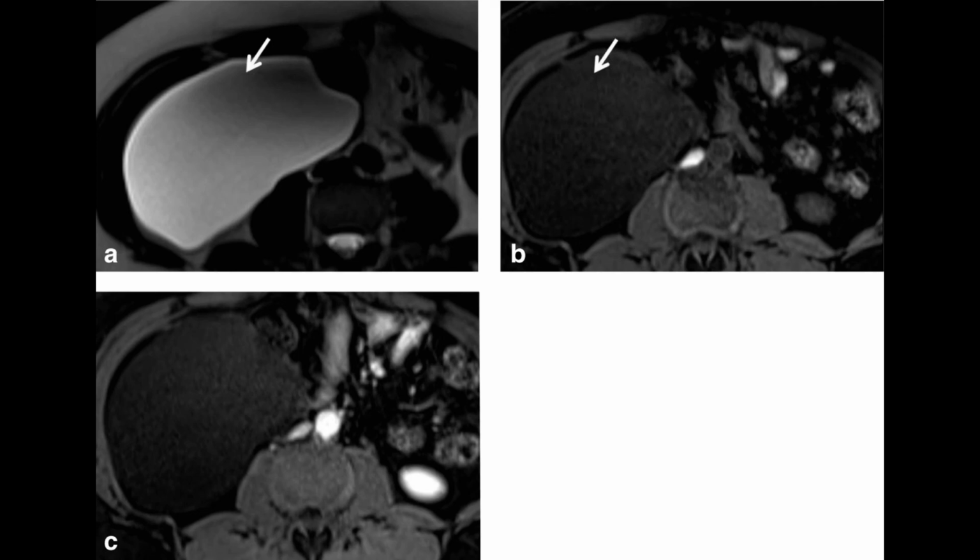It can be lymphangioma, which usually is multiloculated, but if it is a single lesion, then it can be a duplication cyst, it can be a pancreatic pseudocyst, or it can be a mesenteric cyst. So these are the different cystic lesions which we can see in the abdomen. So this is how we approach any mesenteric lesions. See whether it is a cystic lesion, see whether it's a solid lesion. If cystic, see whether it's a single cystic, or multiple cystic, or multiloculated cystic.